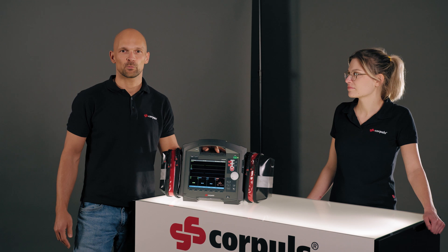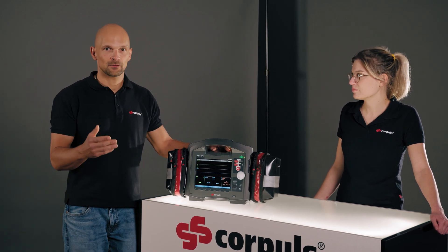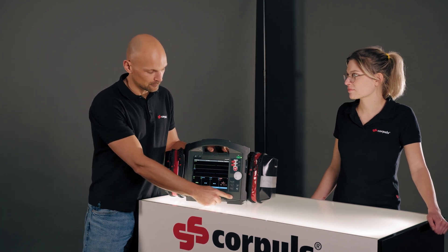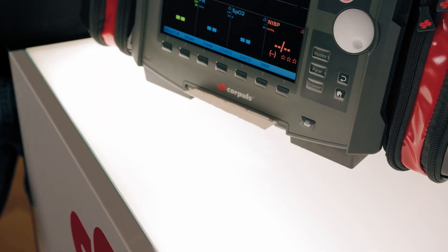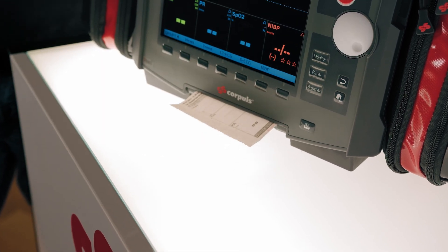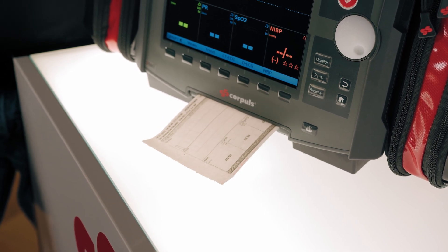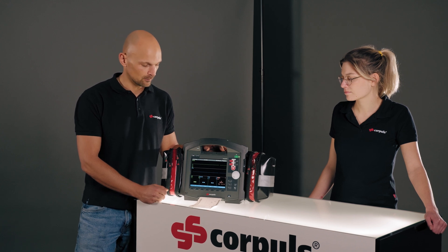As the next function test, we want to check if the printer is working properly. Printing out a screenshot is ideal for this. I can create it by pressing the printer icon for three seconds. The screenshot will be printed automatically. Here I can easily see whether the printed image is perfect, or whether I can see any red stripes that would indicate that the paper is about to run out.